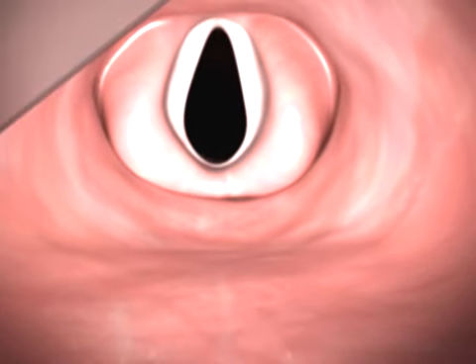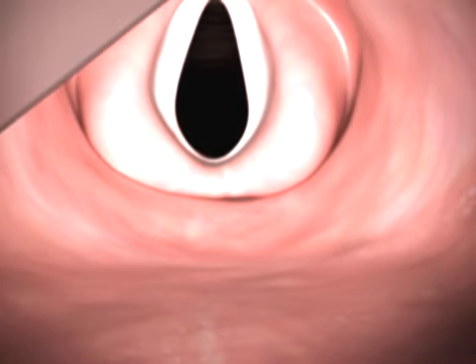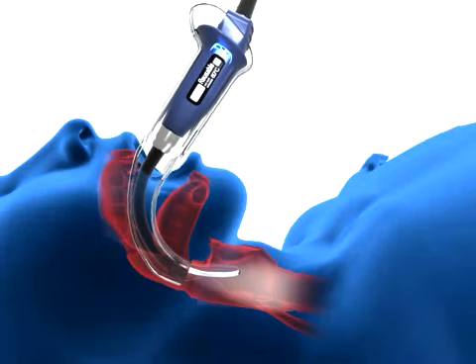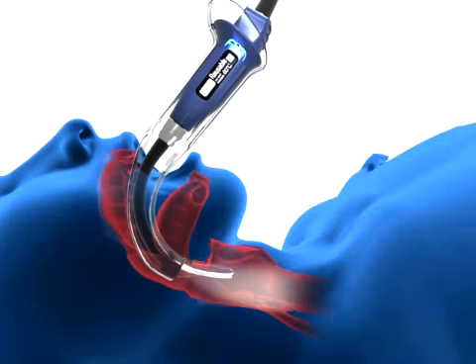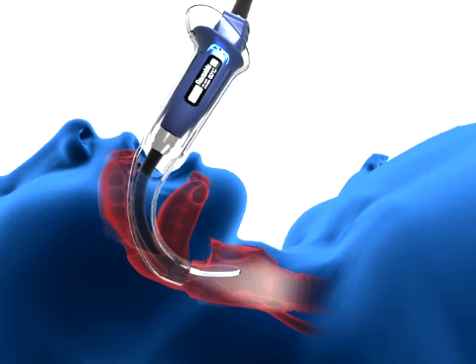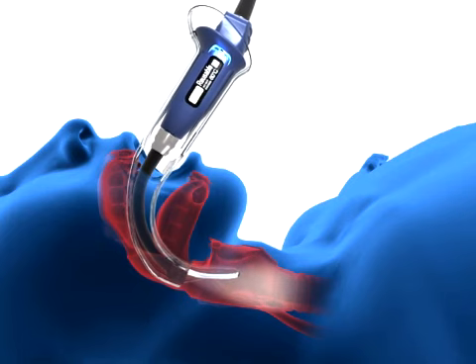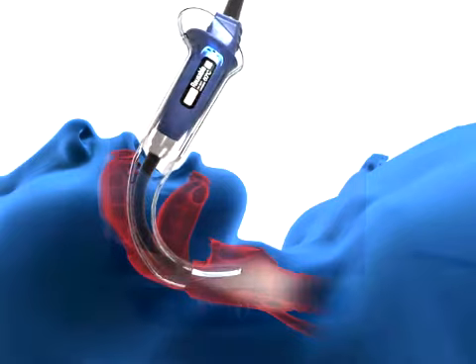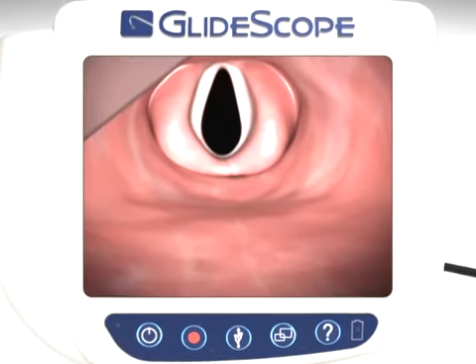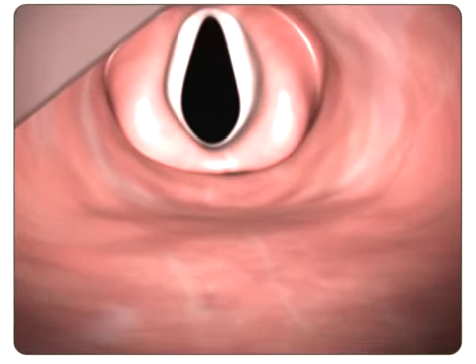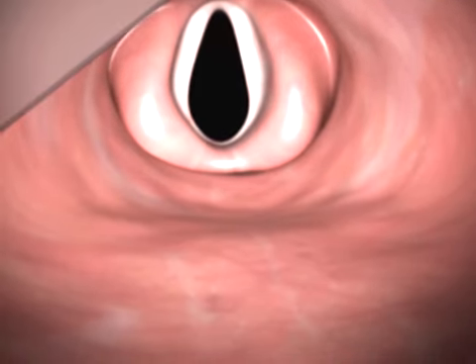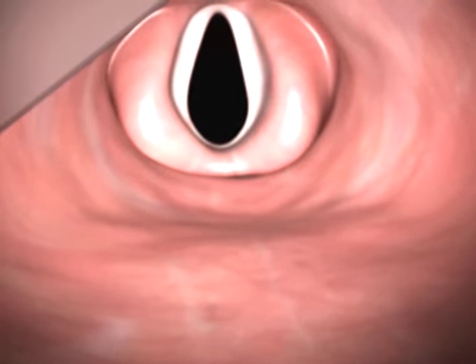The glottic view is optimized by a combination of advancing or withdrawing the laryngoscope slightly, while increasing the tilt to seat the device in the vallecula or on the posterior surface of the epiglottis, to obtain the best glottic view. When the Glidescope Video Laryngoscope is appropriately positioned, the glottic aperture is centered in the upper third of the video display.